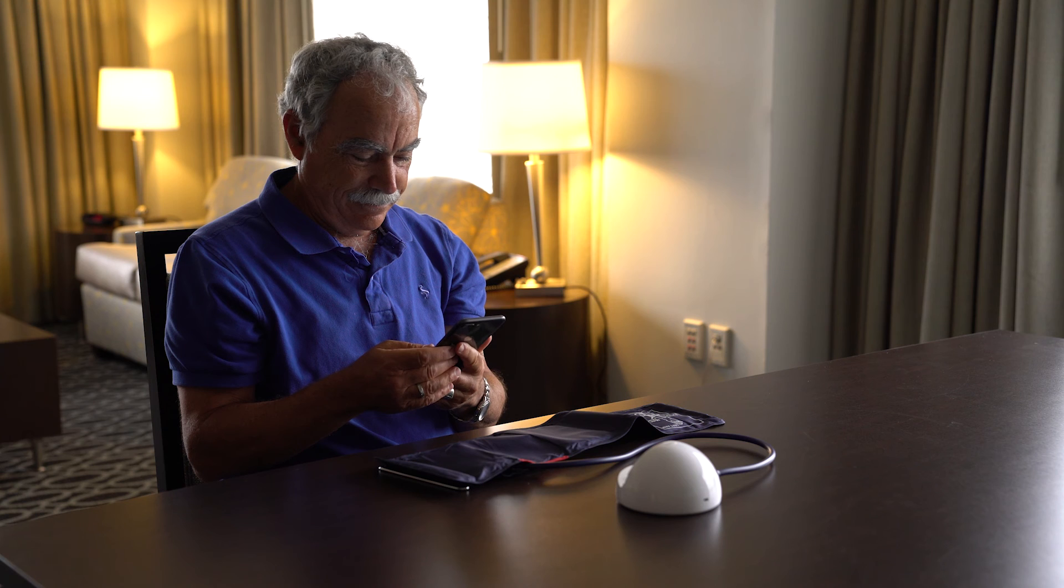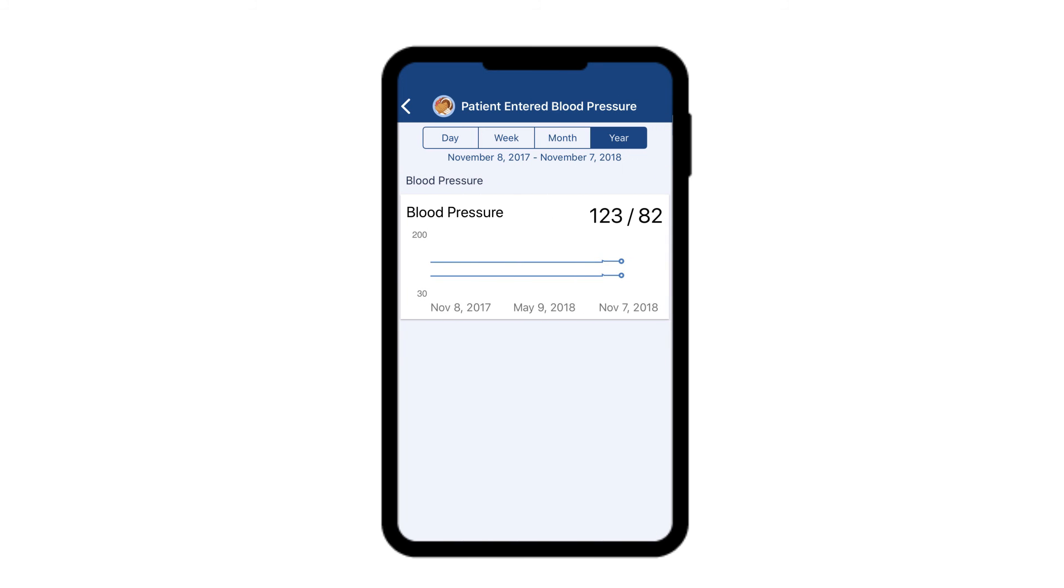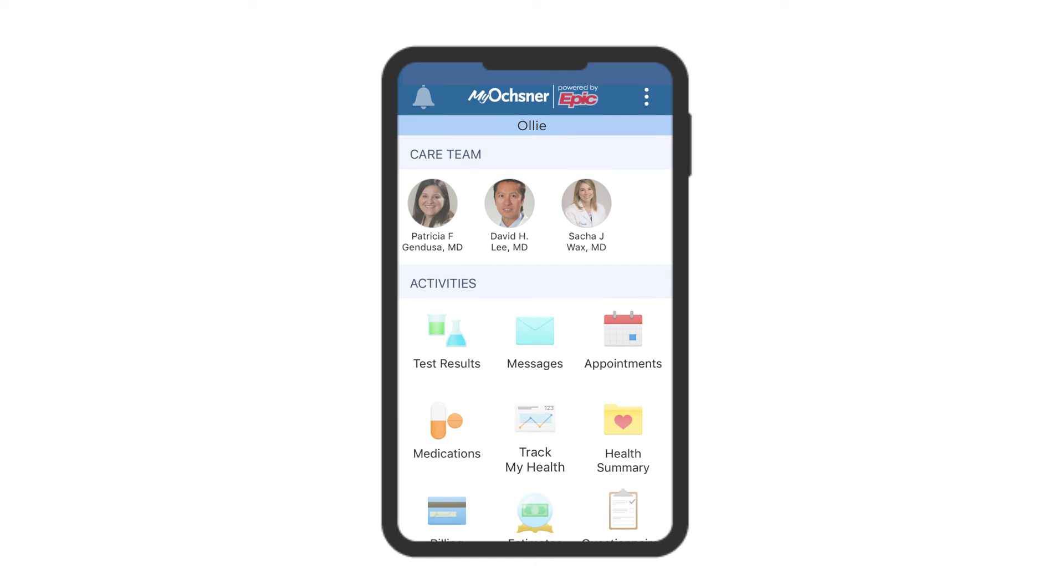You can verify that the reading has transmitted by opening your MyChart app and clicking on Track My Health. From there, if you have any questions, you can easily message your care team through the MyChart app, keeping you connected to your care.